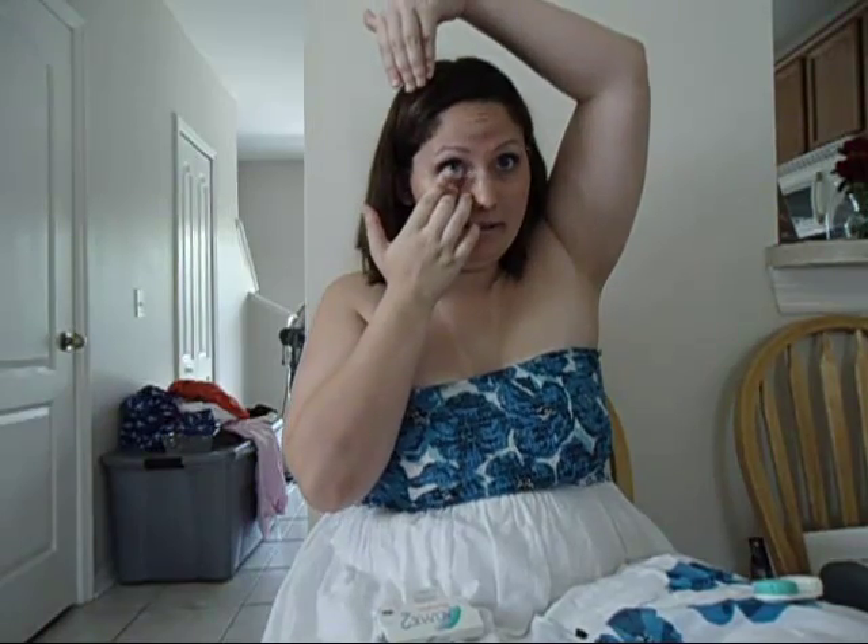I already have mine in — I did my makeup so I don't want to ruin it. But normally how I do it is I pull this lid down, I pull this lid up, and then I just kind of place it on. And then sometimes you have to blink, blink, blink until it gets positioned right, and that's pretty much all you have to do.